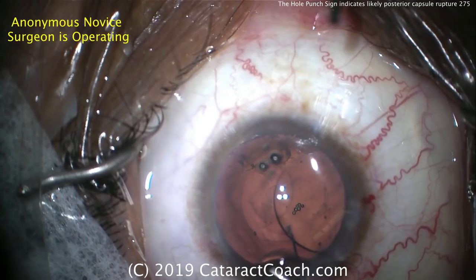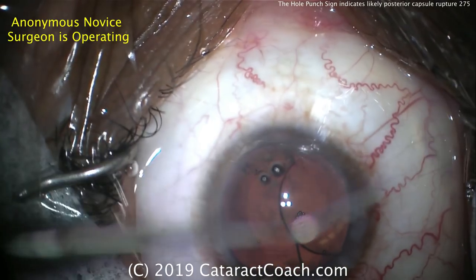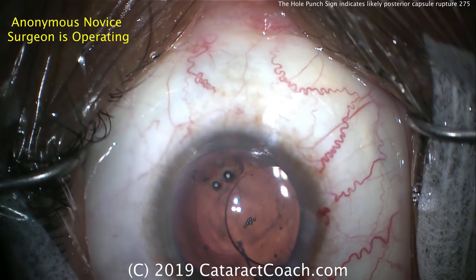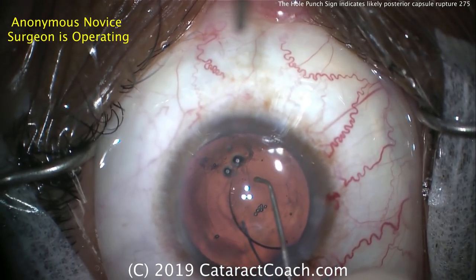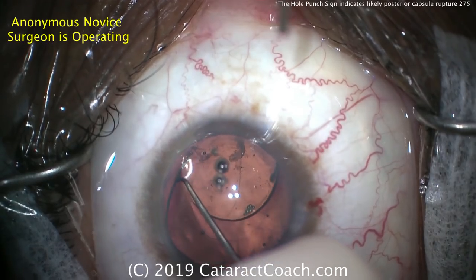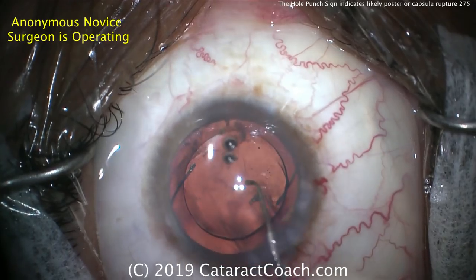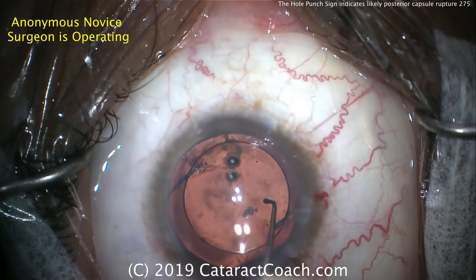Now the lens needs to be centered up a little bit better. Thankfully, at the beginning of the case there was a beautiful capsular rhexis, so this would be an ideal case to get optic capture. We'll have the haptics in the sulcus and then get the optic buttonholed and captured behind the anterior capsular rim — that's going to give us a very stable long-term solution to fixate this IOL. It also creates a barrier effect so there's less likely to be vitreous prolapse through there. There it is in the sulcus — that looks beautiful. The optic is being pushed through — a nice buttonhole. That's very stable, that's going to be beautiful.